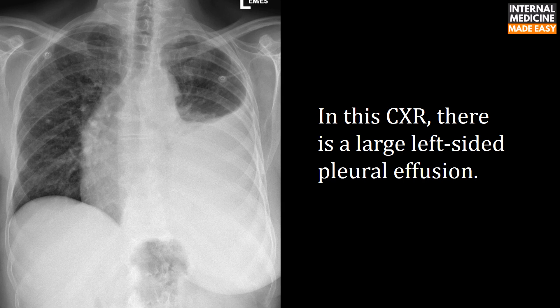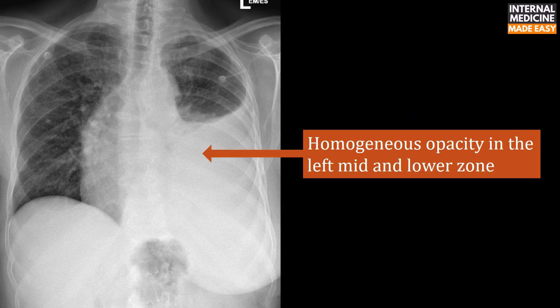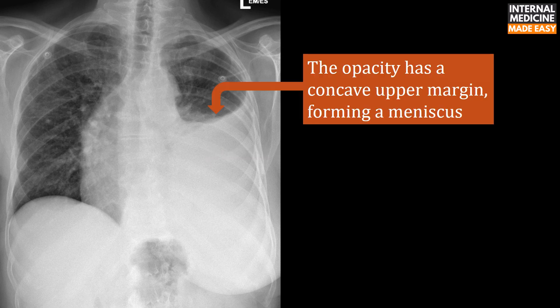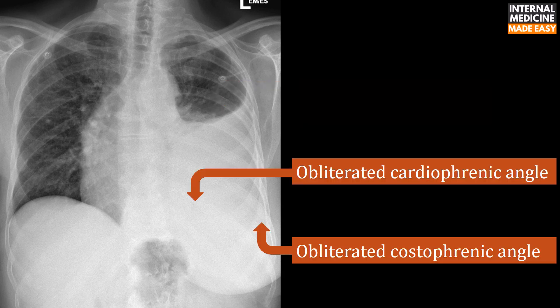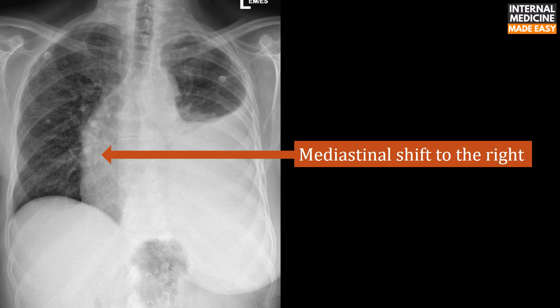In this test X-ray, there is a large left-sided pleural effusion. There is homogeneous opacity in the left mid and lower zone. The opacity has a concave upper margin, forming a meniscus. The cardiophrenic and costophrenic angles are obliterated, and there is mediastinal shift to the right.